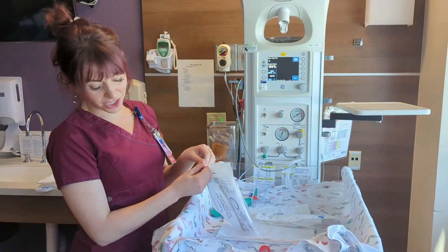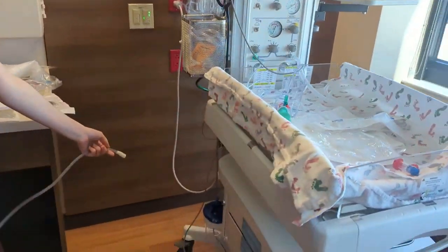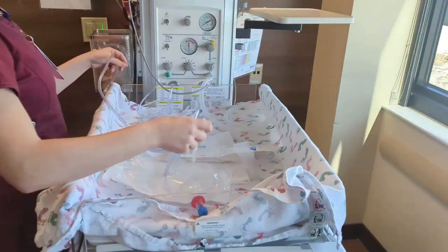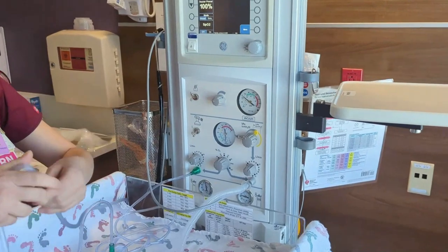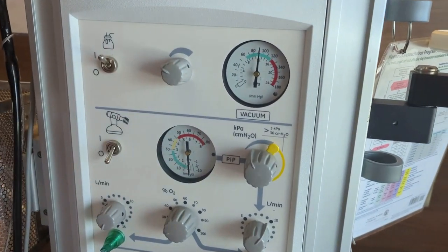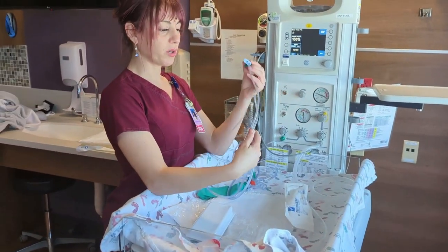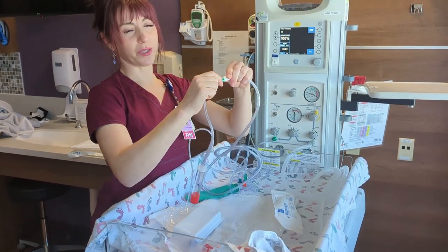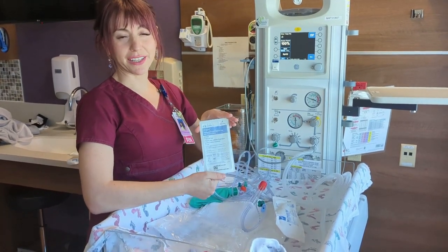Next, we're going to add our suction device and check that. The suction is located on the side of the warmer. We'll lift this up — this is our dial. To see where I want it, I'm going to kink our tubing and set it at about 80 to 100, then release. At the end of this suction device we have a few options depending on your facility. One is a DeLee, which we put at the end of the suction tubing. To use the DeLee, you'll cover up the hole. We also have regular suction catheters that you can attach to the end as well.